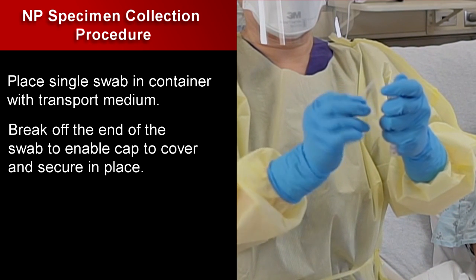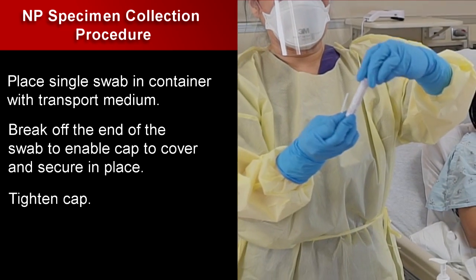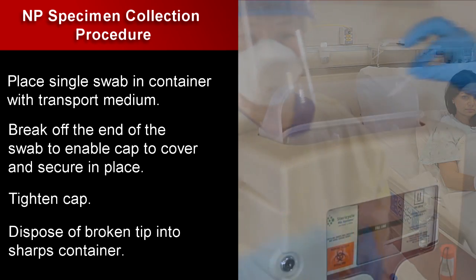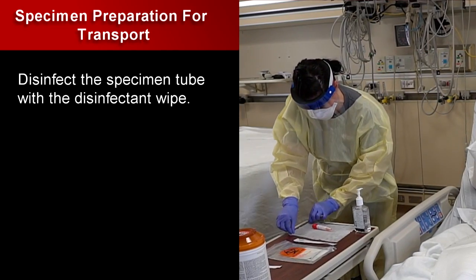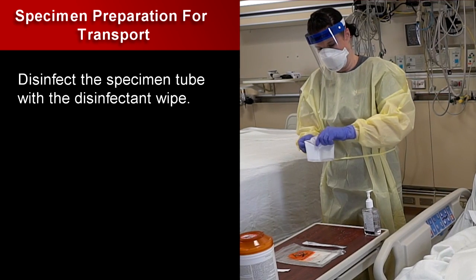Break off the end of the swab to enable cap to cover and secure in place. Tighten the cap. Dispose of the broken tip into sharps container. Disinfect the specimen tube with the disinfectant wipe that is laid out on the table. Place the tube in the specimen bag and seal.